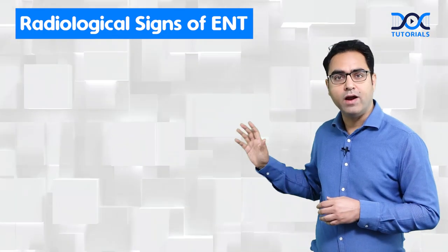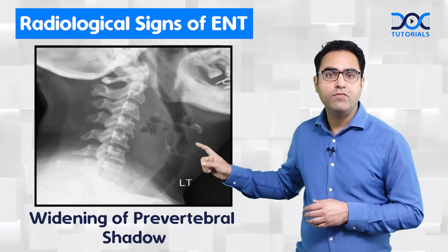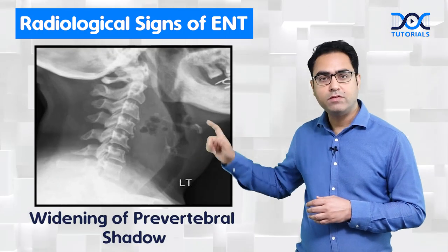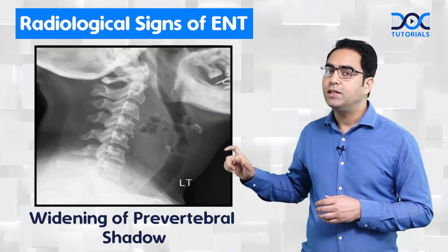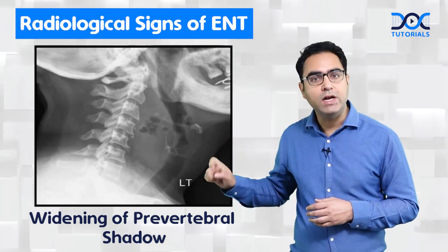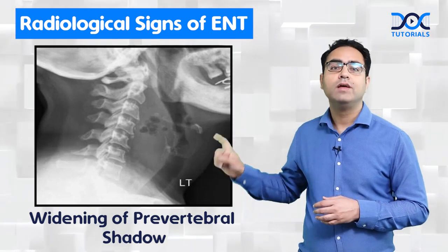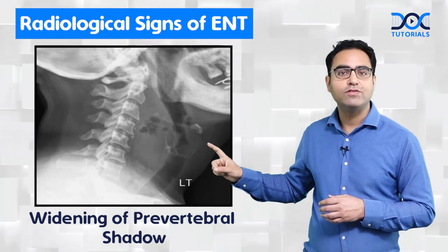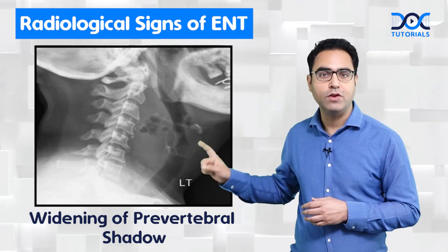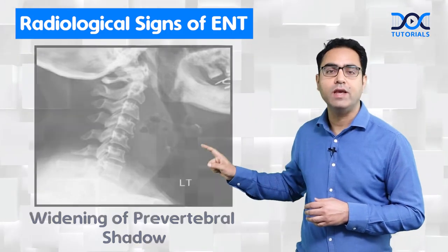The next sign shows widening of the prevertebral shadow with a normal cervical spine, and the child is having respiratory difficulty with stridor. This is a case of acute retropharyngeal abscess. Can you see the widening of the prevertebral shadow?